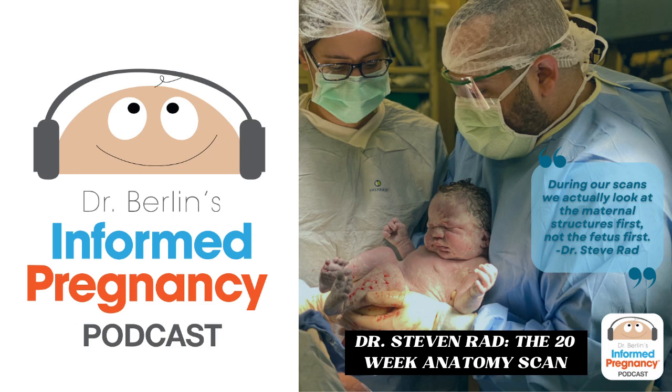But anyways, 98%, 99% of our ultrasound comes down to 2D ultrasound. Real diagnostic work really comes down to 2D ultrasound. 3D ultrasound, you can use it on some structures, particularly the brain. And as I was saying, it's really the fact that the machine has those advanced capabilities. That capability only comes with certain machines, like these advanced machines that we were talking about earlier.